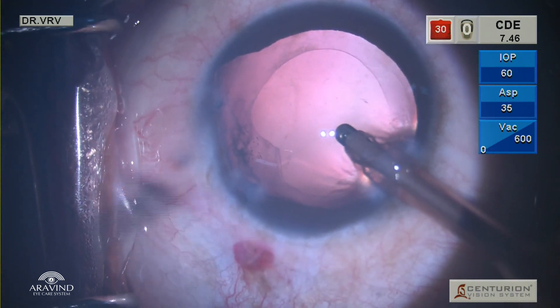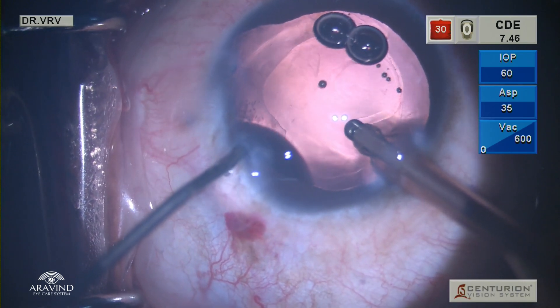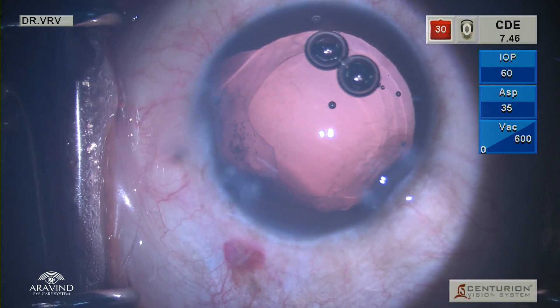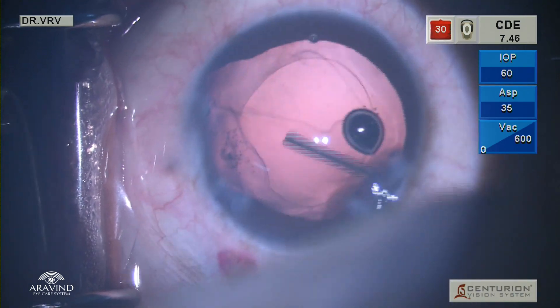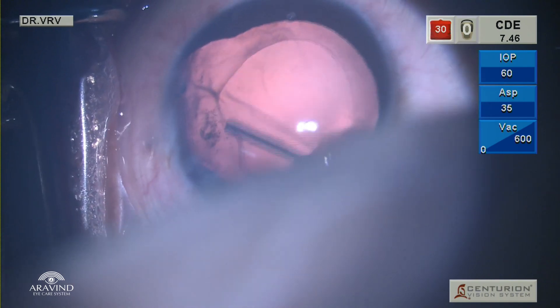Once the cortex wash is done, always inject viscoelastic through your secondary incision and then remove your I&A probe. This is again to prevent vitreous disturbance. Posterior capsular polishing is done to remove all the remnant cortical fibers on the PC.